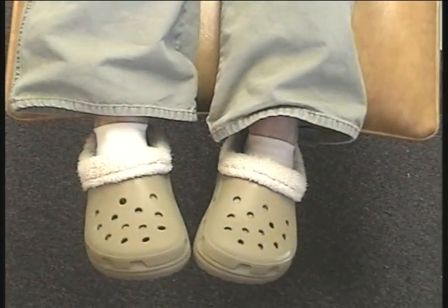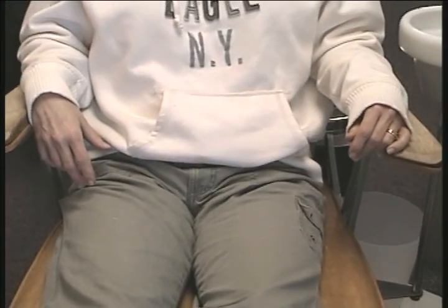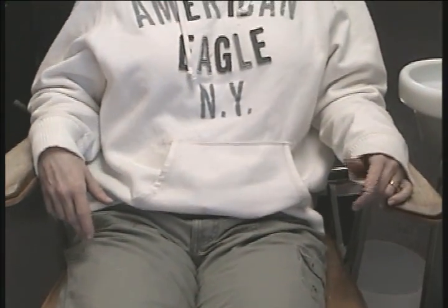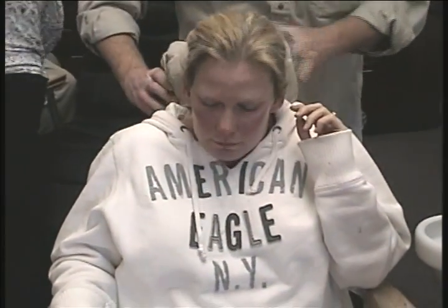This is the very next day. What we wish to accomplish on this is a diagnostic workup, which means a bunch of very sophisticated tomographic x-rays through the temporomandibular joints, impressions, and possibly her splint delivery. She comes with all kinds of head movements, hand movements, foot movements, and pain. Notice the uncontrolled movements of her hands, feet, and head.